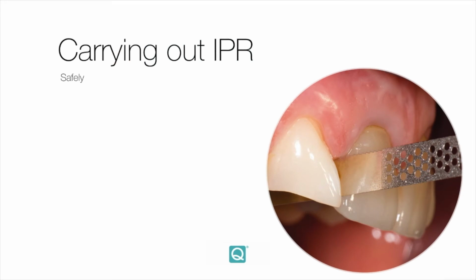So now let's look at IPR and how to carry out IPR effectively and safely. So IPR strips, like we've got in this photograph here, are extremely safe and easy to use. They come in different width sizes, so you know how much IPR you're doing at each appointment.